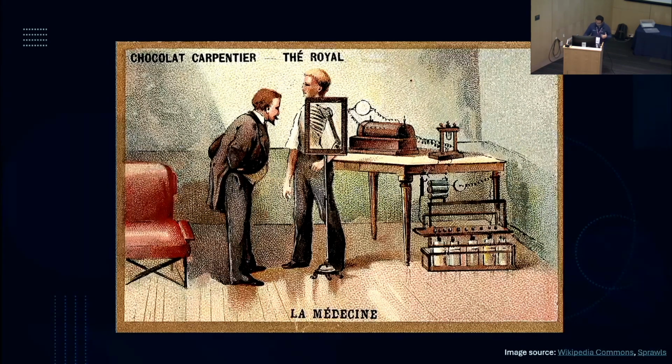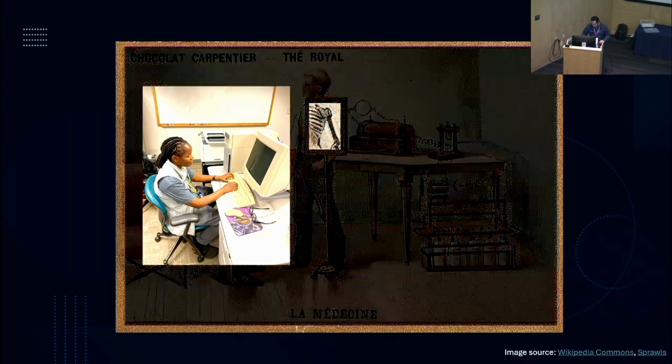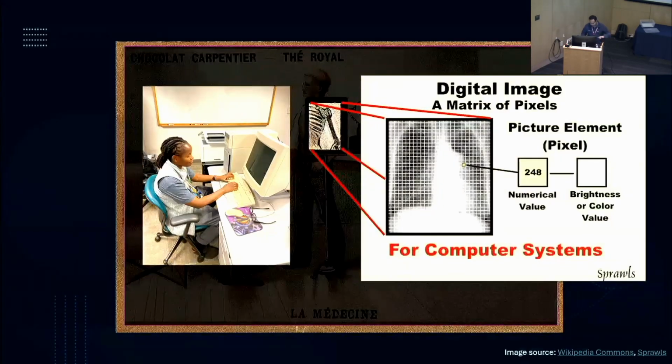So now we go back to this image and how it is constructed. We talked about DICOMs, and Judy and Marley have gone through the DICOM. So we changed this into a more digital version. We have this new imaging processing system, the supercomputer at HITI Lab. And so we take the image, digitize it into small pixels. You can think of this as a tabular data set because it's a 2D array. So for those who are used to tables, this is similar.